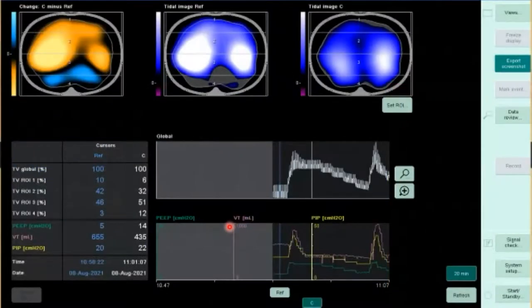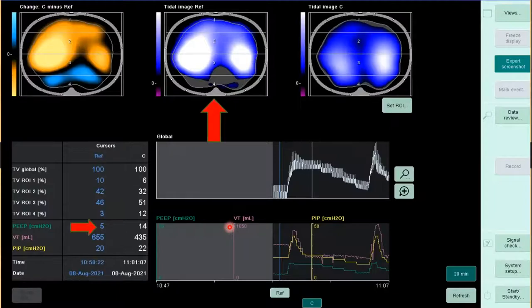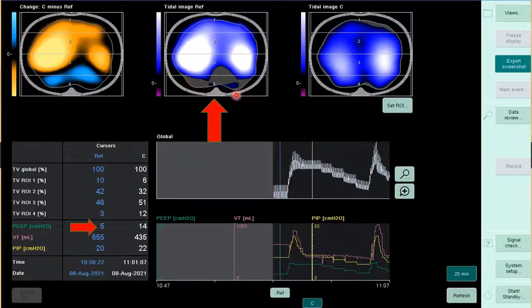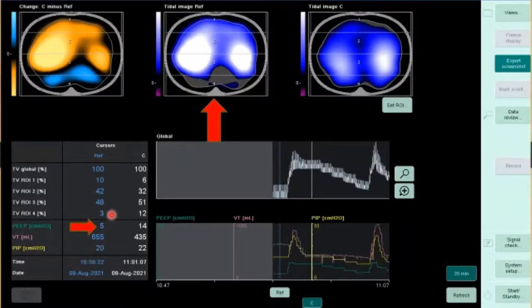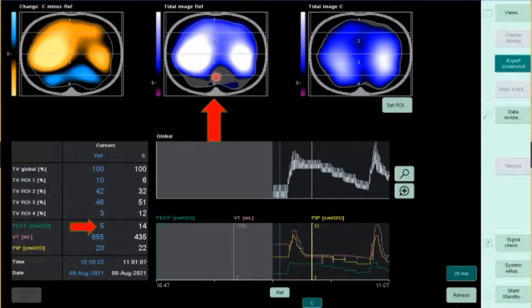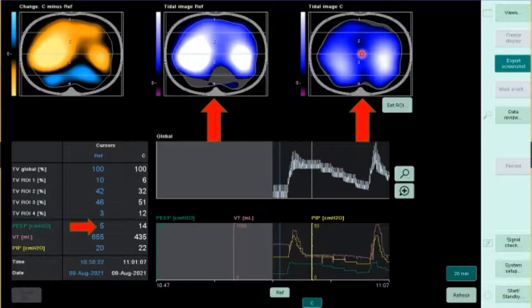Looking at a PEEP titration: with PEEP at 5, there's dorsal atelectasis — only 3% ventilation in the dorsal region. When volume is pushed in with collapsed dorsal regions, the mid and ventral areas face increased stress and strain due to reduced surface area. When PEEP was increased in an attempt to recruit the dorsal area, we successfully recovered ventilation. The color-coded difference map shows blue where ventilation increased (dorsal) and orange where it decreased (mid area) — showing redistribution of ventilation to the newly opened dorsal region.